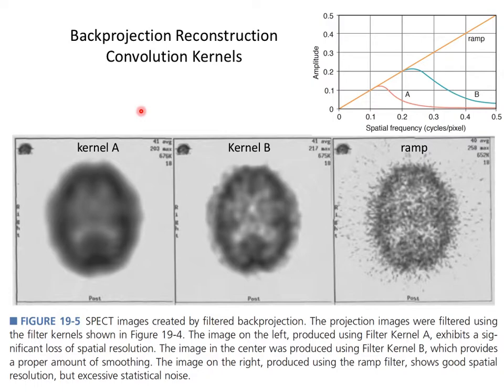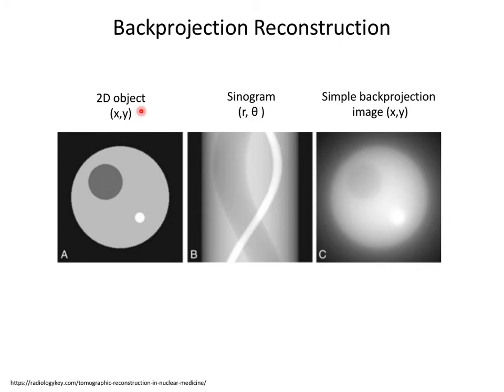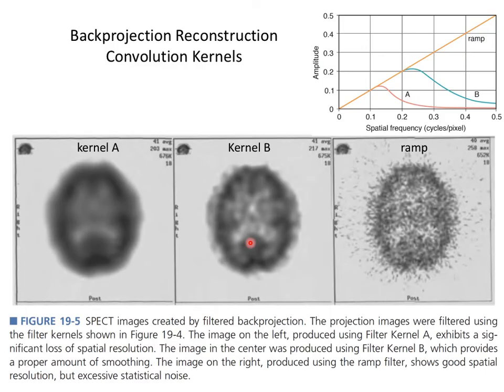There are different ways to do this back projection. The most accurate way is to just apply it in terms of spatial frequency. Now this is tricky because I don't think we've looked at the Fourier transform, right? How many people know the 2D Fourier transform? Hold up your hand. Know what that is? You do? Really? Okay, about half of you.